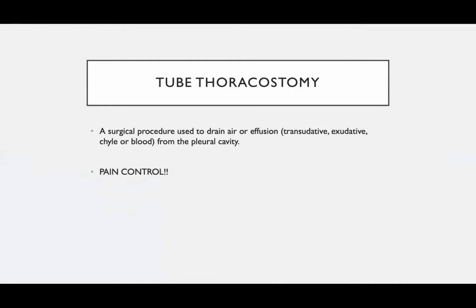So basically, any chest tube for surgeons or even physicians, because as you know, emergency physicians and even intensivists are helping us to put chest tubes. Sometimes it might be a little bit difficult to put a chest tube, but you always have to follow a systematic way of draining the pleural cavity.